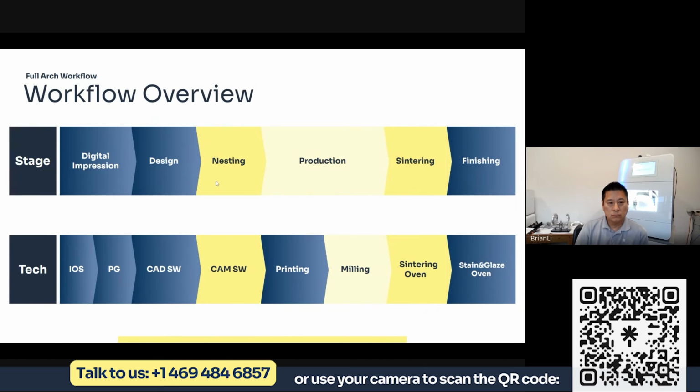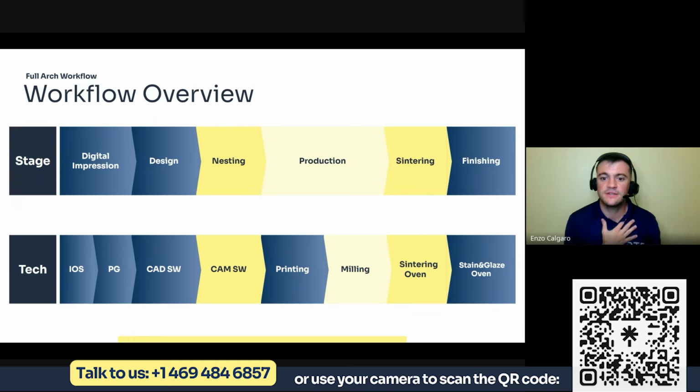So now I think I've talked a lot. We've covered the basics of the workflow. Now Brian is going to take it from here. What he's going to be showing is, we're going to pretend on our demo here that we have the scanning and designing ready. Brian is a lab tech, whether inside a clinic or inside a lab, and he got the designs ready, and he's going to put it to mill. Brian, I think you can take it from here.